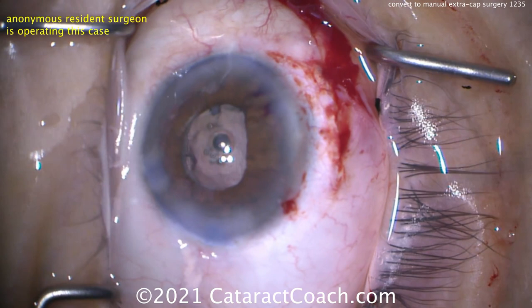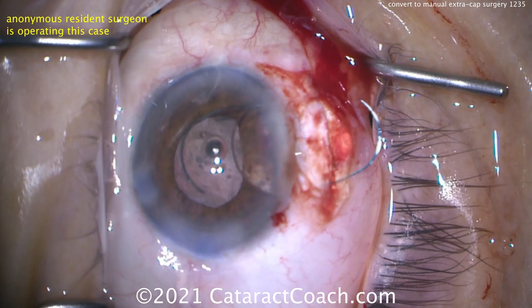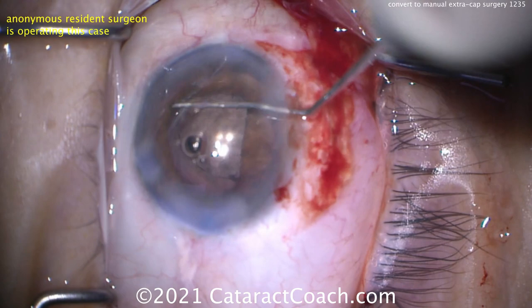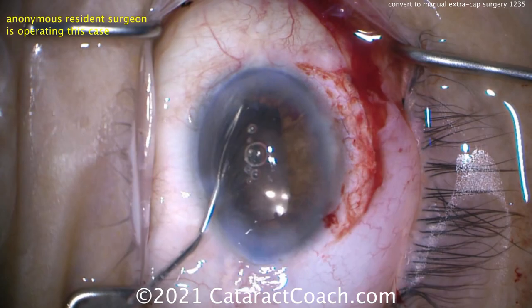Fill up the sulcus with just a little bit of viscoelastic — don't inject huge amounts because it'll go back into the vitreous cavity after the vitrectomy of the anterior hyaloid face. Cut that suture out. You don't need a lens injector — this three-piece lens can go right in the eye through the large incision. Fill up the anterior chamber with cohesive viscoelastic. This is not a fast procedure; the actual unedited video is about 50 to 55 minutes.